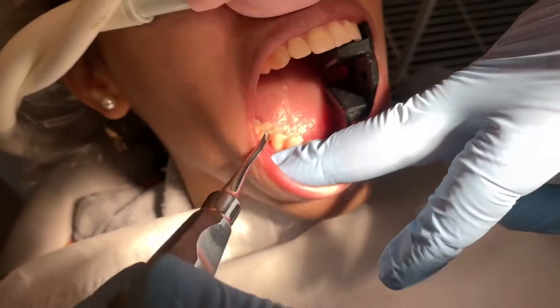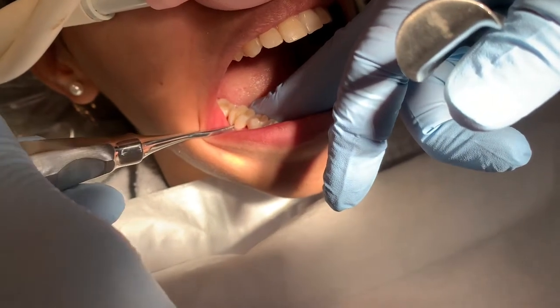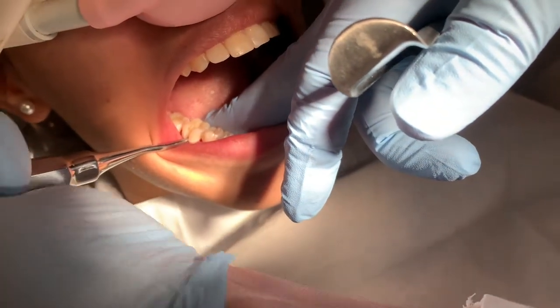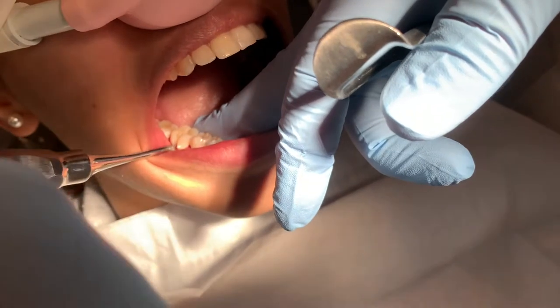Okay, so the next thing I'll do is I want to get in here and just make sure we have the tooth in two pieces. So I'm just going to wiggle this. You may hear a little pop or something. Okay, the tooth finally gets into two pieces. You can hear a little bit of stretching noises sometimes.